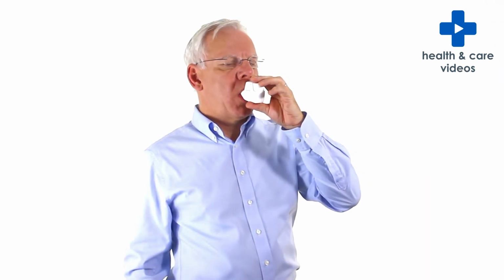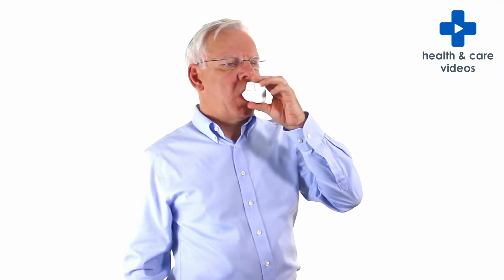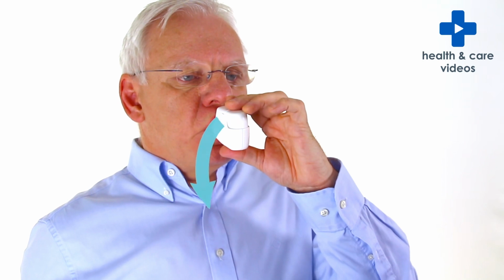Breathe in through your mouth strongly and deeply. You will hear the inhaler click, which indicates that you're using the inhaler correctly, but keep breathing in as far as you can after the click to ensure you get the full dose.